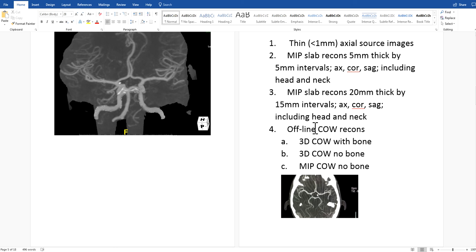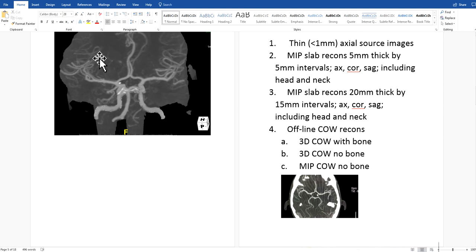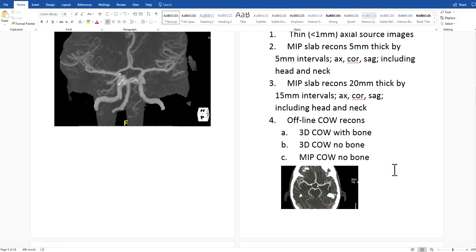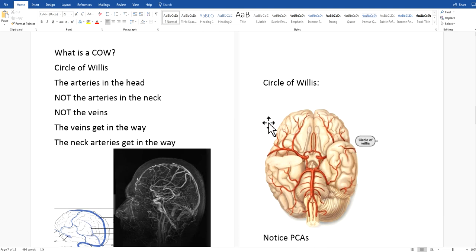This video is how to make these offline COW reconstructions. For reference, these 20mm thick slab recons will have the bones, vessels out to the edge, and the veins. When doing our COW recons, we'll be removing some bone and veins and maybe some peripheral vessels, but that other information will be on the other series — the thick MIP slabs and the thin source image axials.